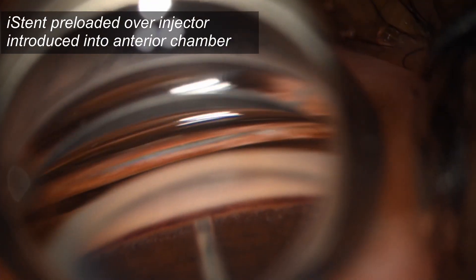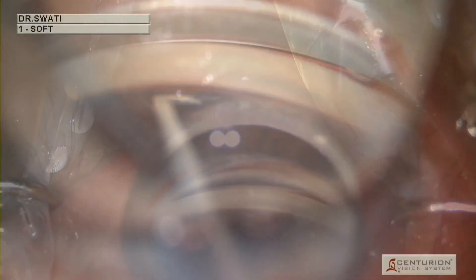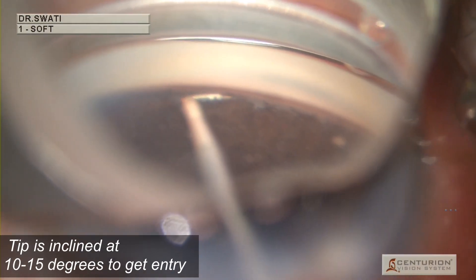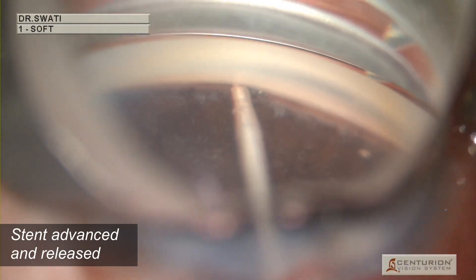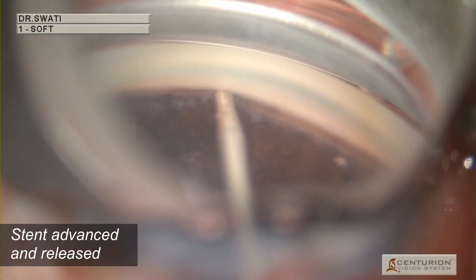The pigmented trabecular meshwork is identified and the iStent preloaded over the injector is introduced into the anterior chamber. For G1, the trabecular meshwork is approached and the tip is inclined at 10 to 15 degrees to gain entry. The stent is then advanced until the open half-pipe is housed in the canal and the stent is released.